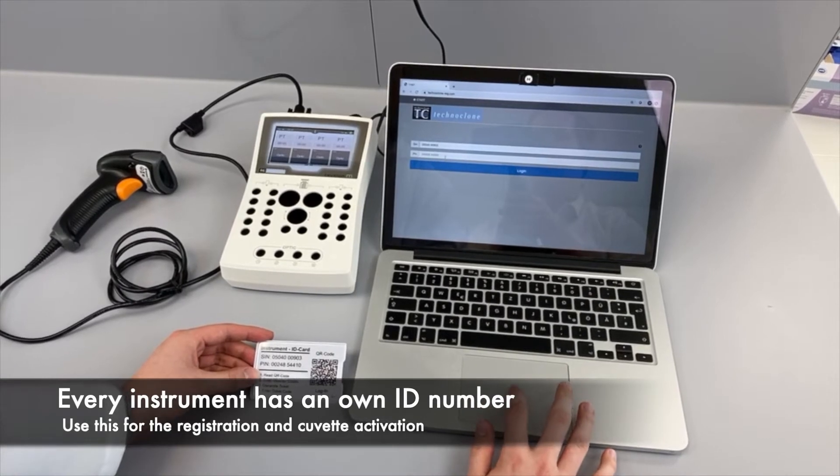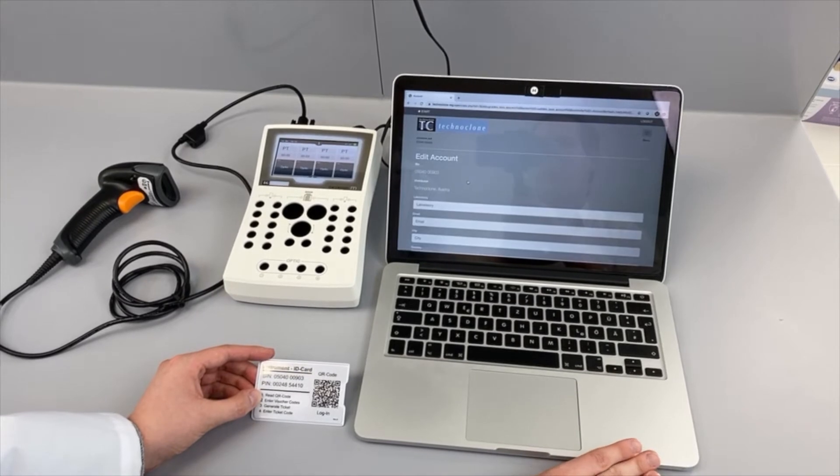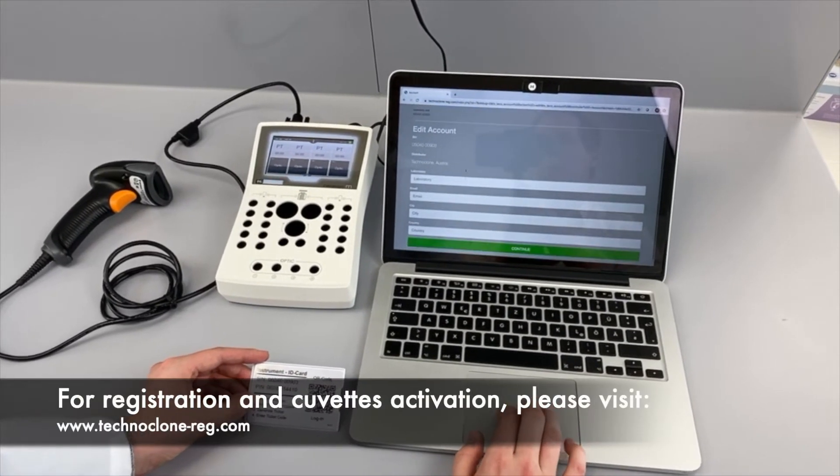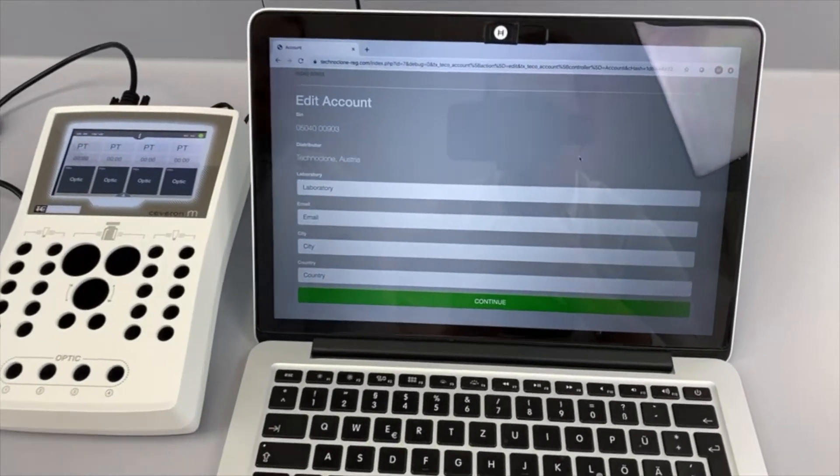After unboxing, register your instrument at Technoglone's registration page using the unique product and system identification number. This can be done by using a computer or internet-capable phone.